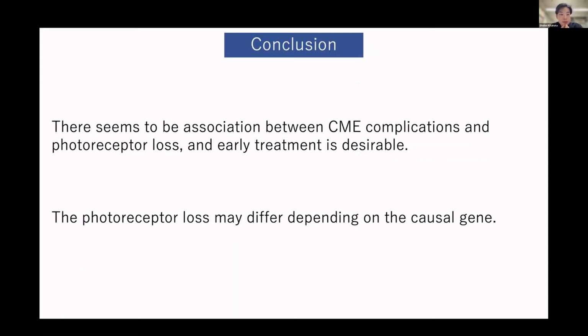So this is the conclusion. There seems to be an association between CME complications and photoreceptor loss, and early treatment is desirable. The photoreceptor loss may differ depending on the causal genes.